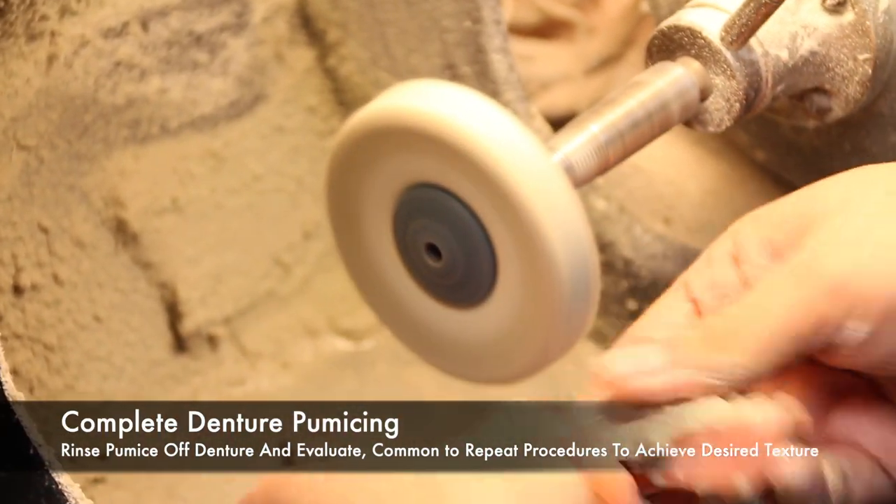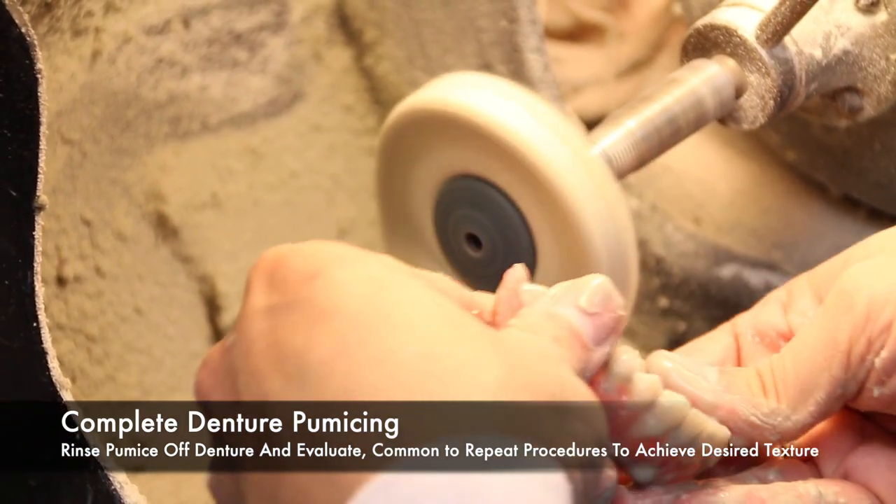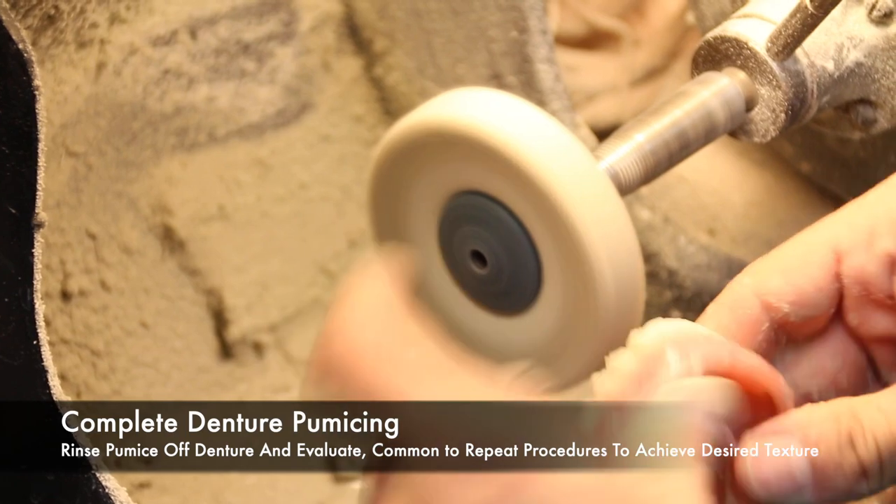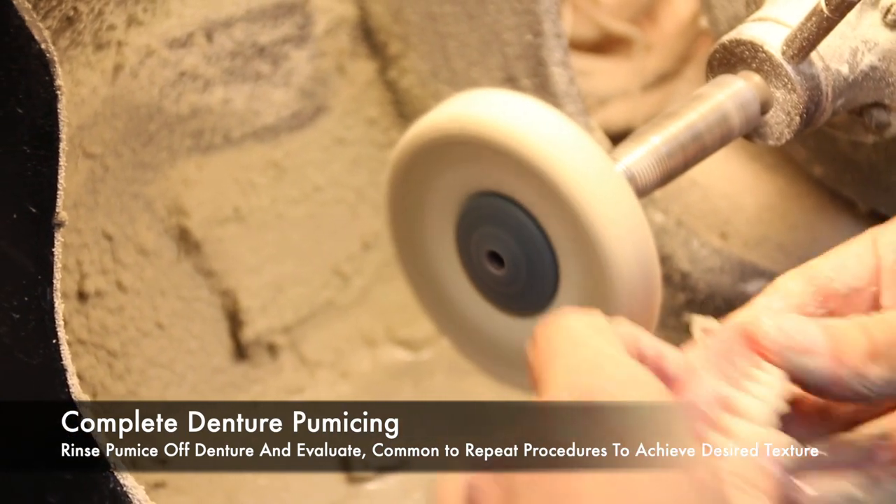Once the pumicing procedures are complete, you can rinse the pumice off the dentures and evaluate. If there are any rough spots, it is common to repeat the procedures to achieve the desired textures.